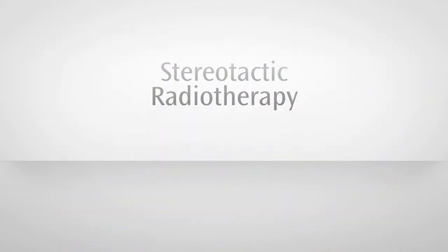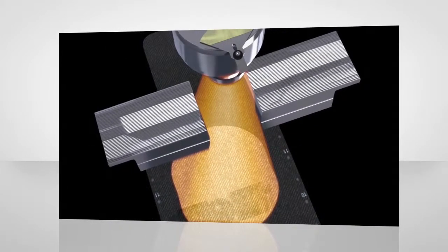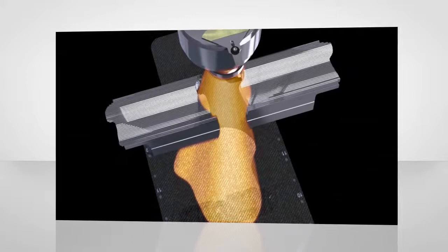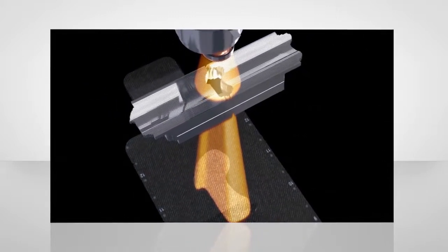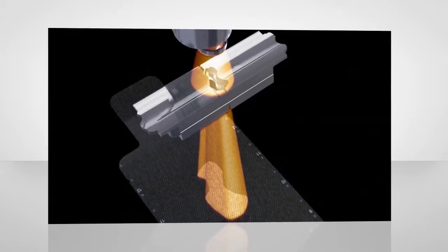Your treatment will involve stereotactic radiotherapy, or SRT. This treatment method delivers very intense and precisely focused doses of radiation to a tumor target while sparing nearby organs and critical structures.